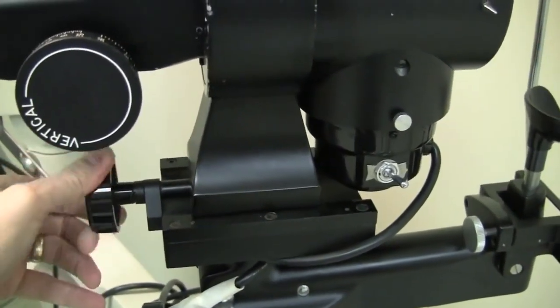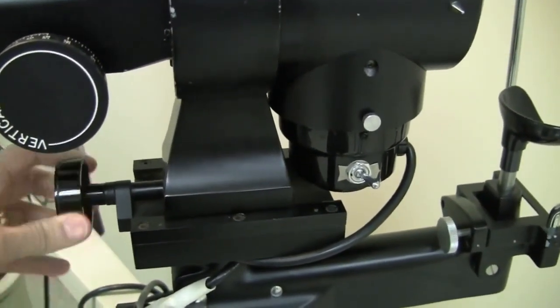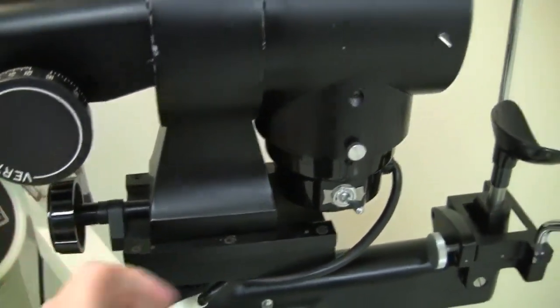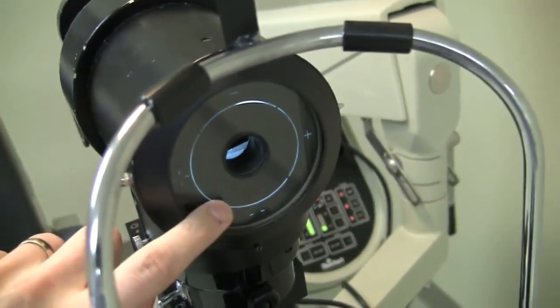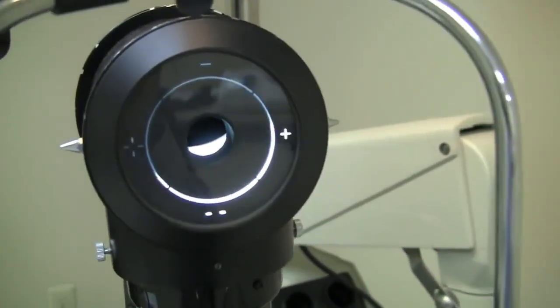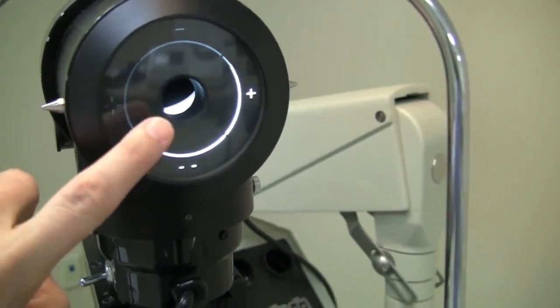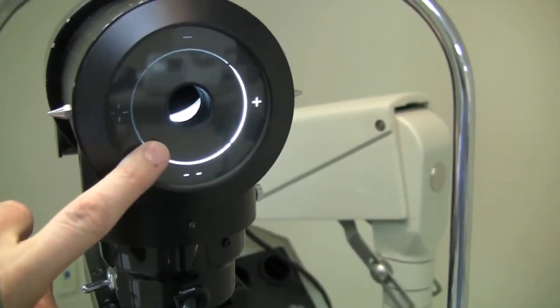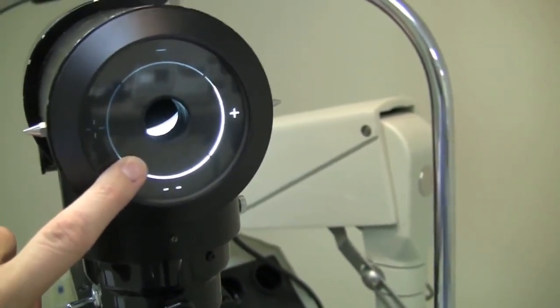If you turn the knob, you'll see that the whole thing is scooting forward a little bit and then backwards a little bit. And the whole point of doing this is to get this end of the instrument, where we have this circle, closer to and farther away from the patient's cornea. The whole thing works by reflection, so this circle target at the end of the keratometer is the object for the eye. The eye, of course, is acting like a mirror in this case, as light reflects off of it, and that's what you're measuring.